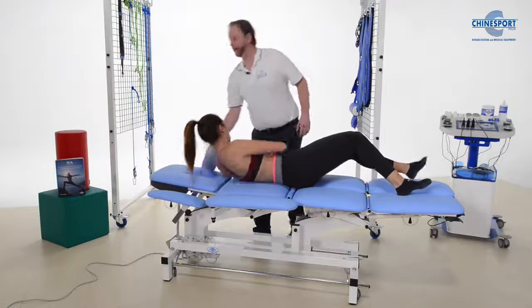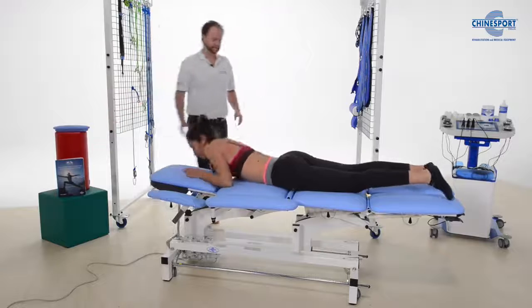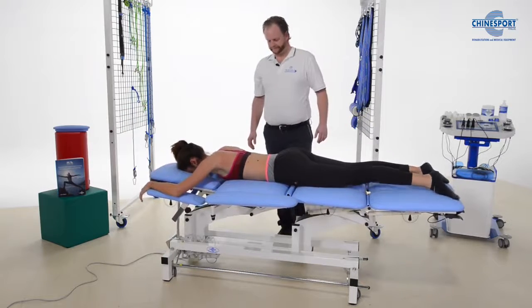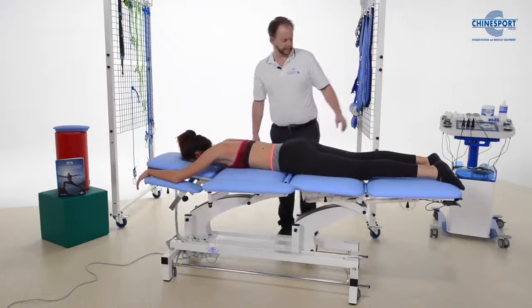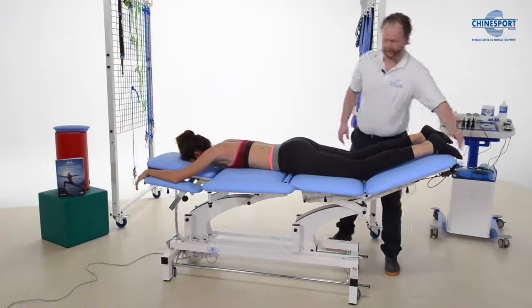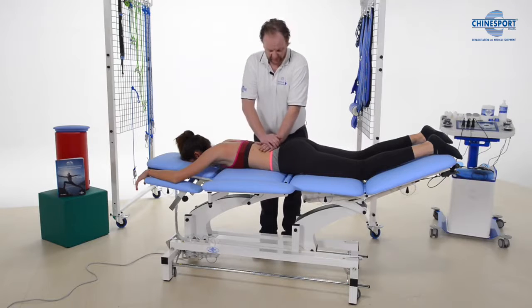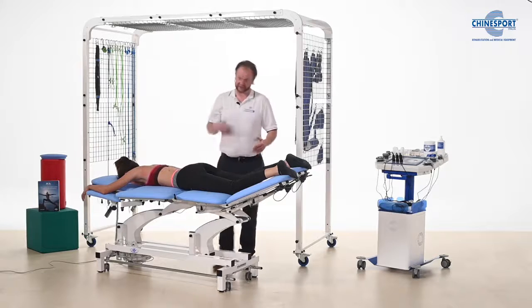And then our patient can lie on her back, or on her front, rather. We can use this here to take some tension off the neural structures. We can do our mobilizations, posterior to anterior mobilizations through the spinous processes or through the transverse processes.